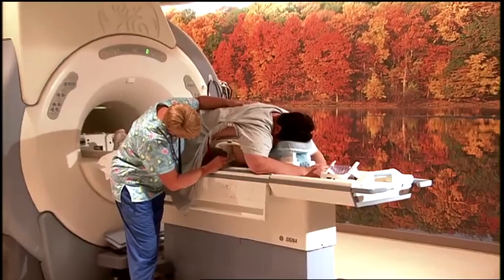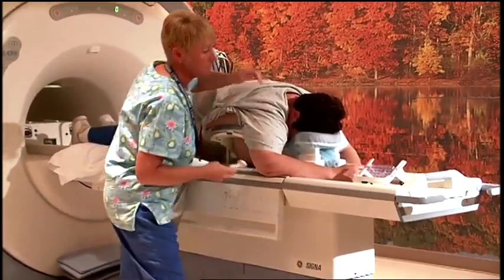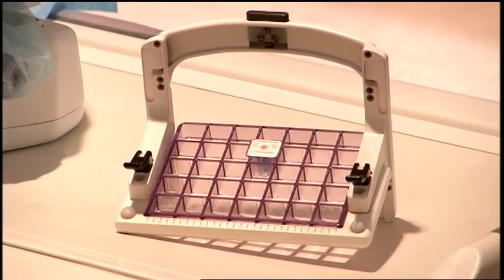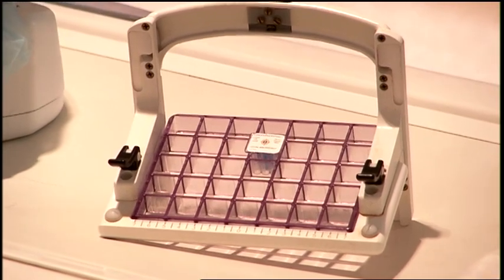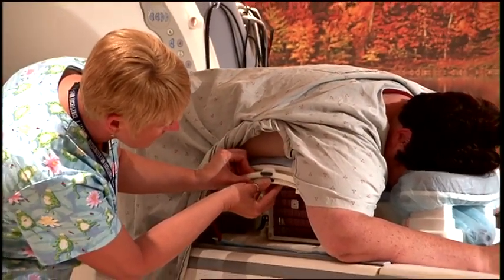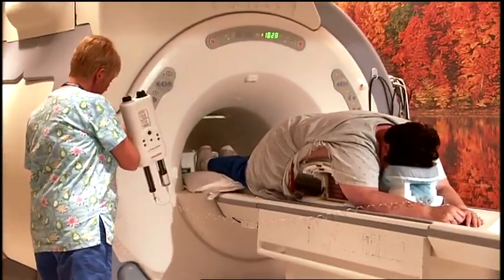During the procedure, the patient lies on the table with her breasts suspended through a special opening. The breasts are slightly compressed. A marker is placed through the grid so that it touches the patient's breast. An open grid is positioned on the side of the table to guide the procedure. The table and patient are advanced into the MRI.